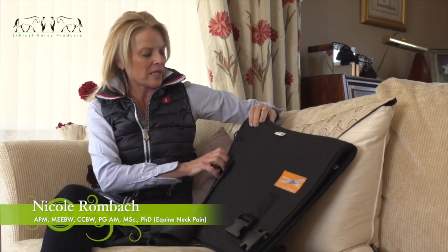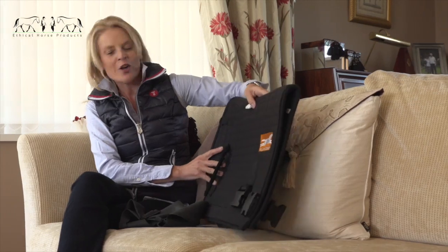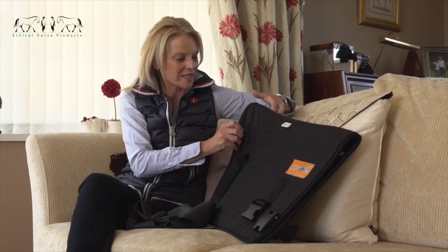So can you tell us how the Equiband works? Yes, so essentially the system itself is comprised of a saddle pad. The saddle pad, and this is an example of a pony size, so it's not to large scale, as it were. So if it appears smaller, it is because it's a smaller size.